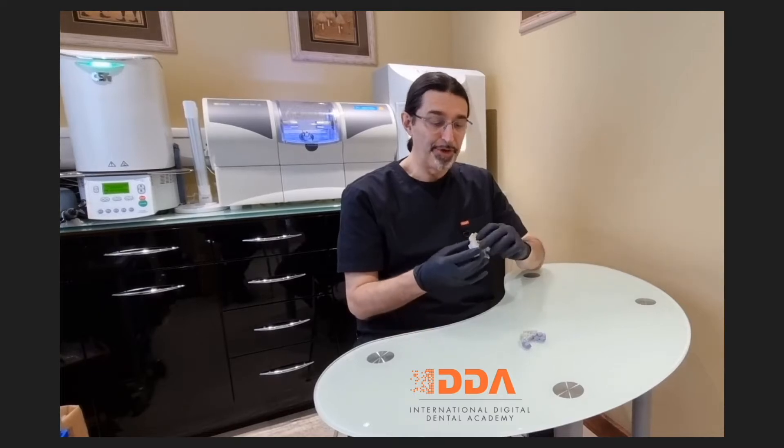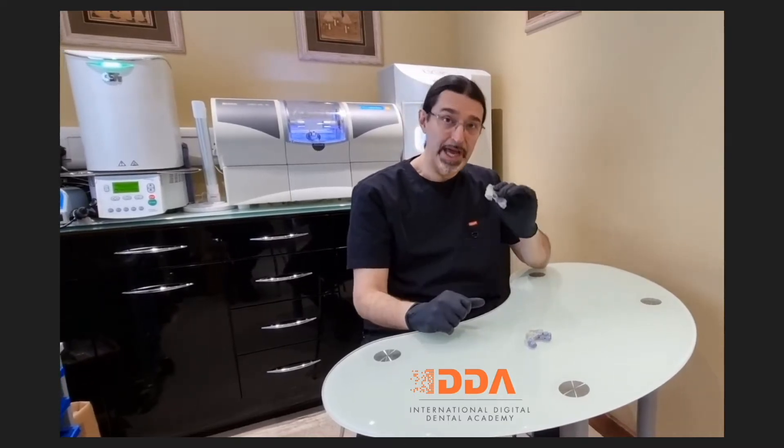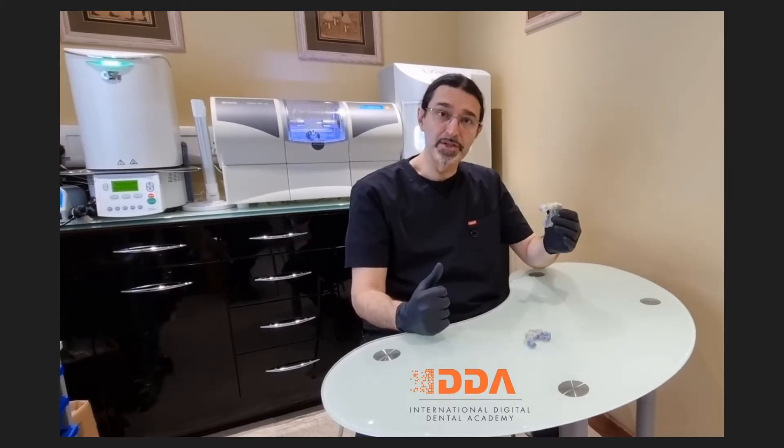Welcome to another IDDA Minibytes tutorial. In this tutorial we are going to consider the successful print of the 3D surgical guide to ensure not only an accurate fit of our guides but also accurate placement during guided surgery. In other words, how do we process these surgical guides for the printing to ensure we have an effective product to deliver what we intend to deliver? Let's find out.